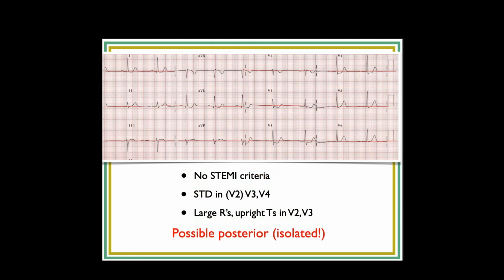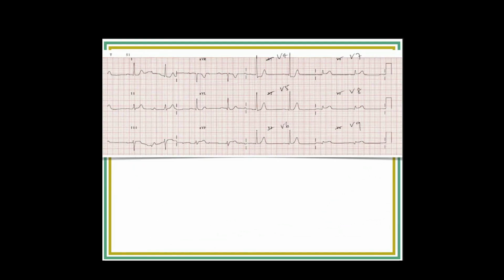Now, this might be a time where you might want to take the time to move them around to the back. Of course, based on what Ann pointed out, it also might be in 5 minutes you're going to have your inferior STEMI anyway, but you might consider it. So I guess the point here, so here's where they did do it. So is there a posterior, V7, V8, and V9?